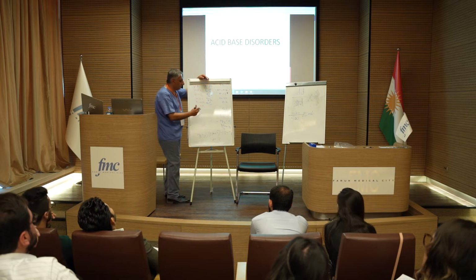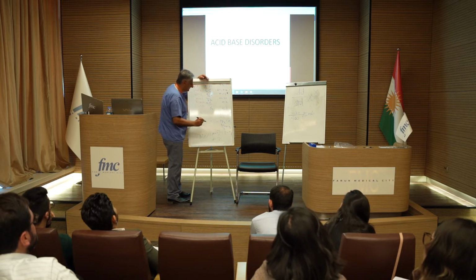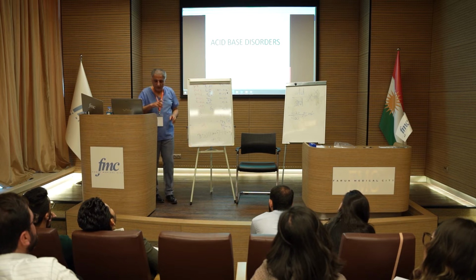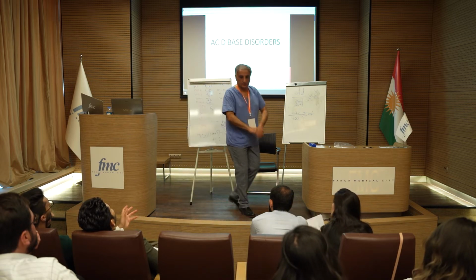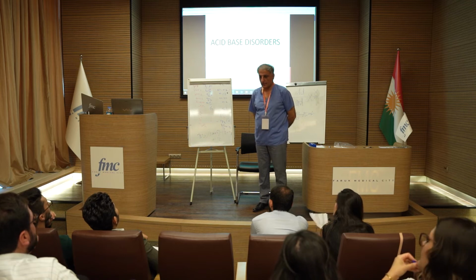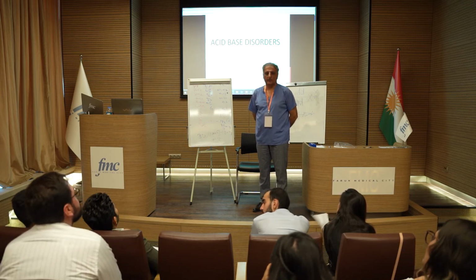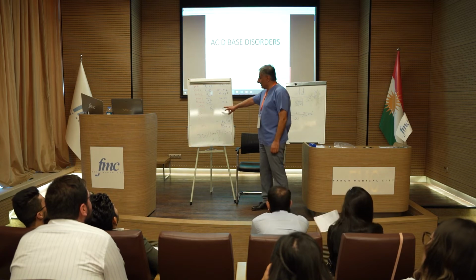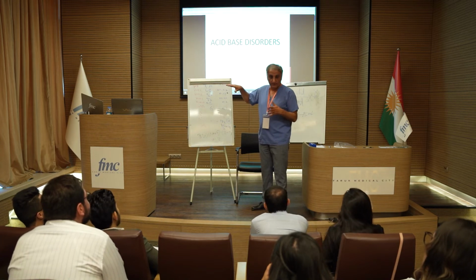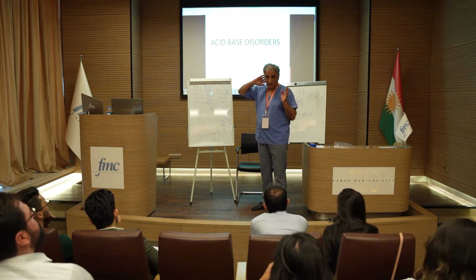Now, if I tell you the lactate is 6, would that change your views? The medical background about the patient, we need more, I think. It points toward respiratory depression. What do you think? Would that make you think of another mechanism or another cause for acidosis, not only respiratory?